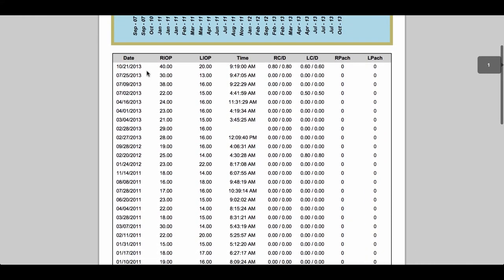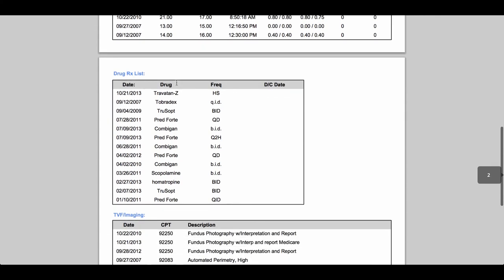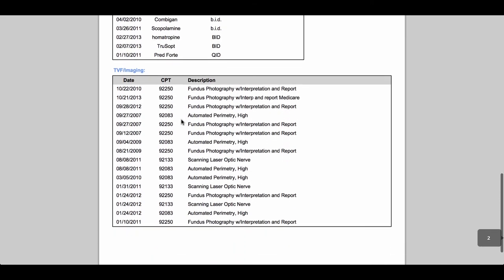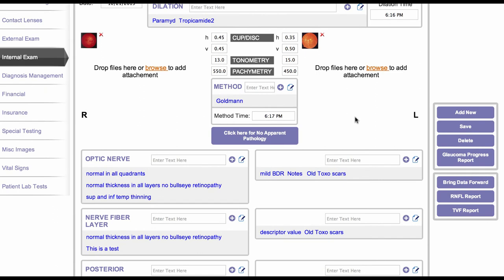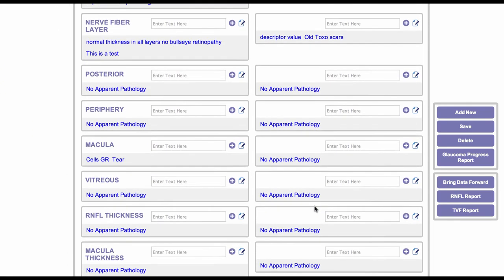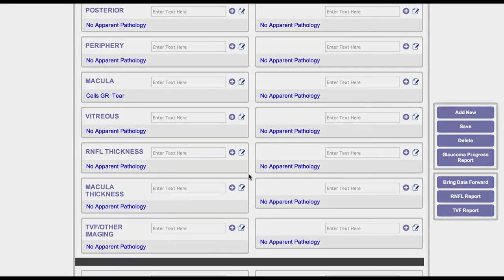You'll also see the actual values here along with cup to disc and pachymetry readings if they were taken. You'll see the list of pharmaceutical agents you've prescribed for this patient over the years, and you'll also see any imaging that you've done. In addition to that, we have a retinal nerve fiber layer report and a threshold visual field report that take the values from these text boxes and put them into a report format so that you can make comments on that.